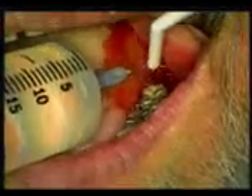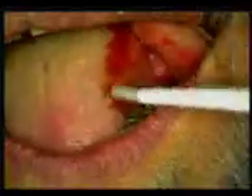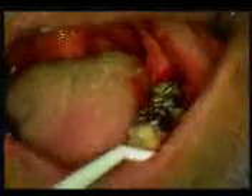Irrigate with normal saline once again — 0.9% sodium chloride. I just like that 60 cc syringe; we can really pump some fluids in there. Just looking at it again and everything seems to be pretty decent.